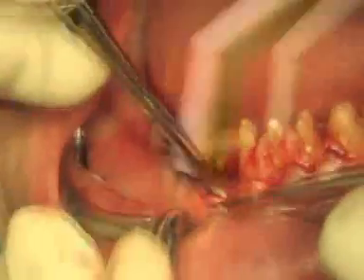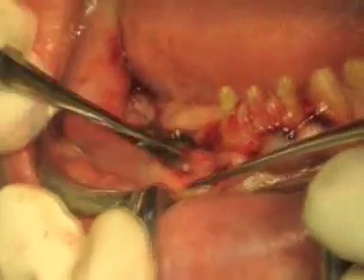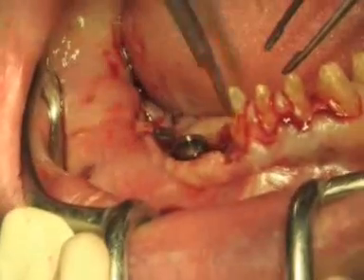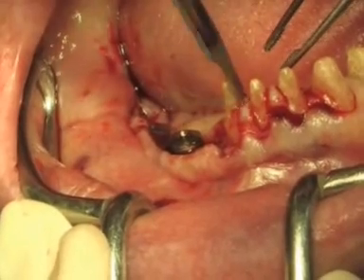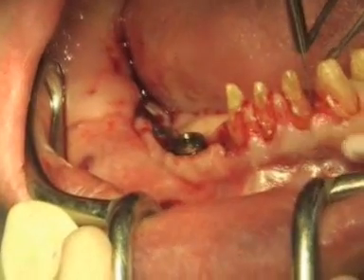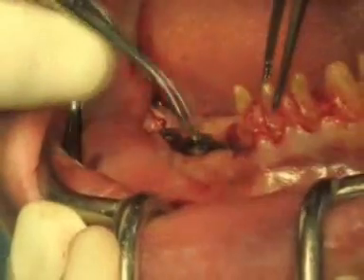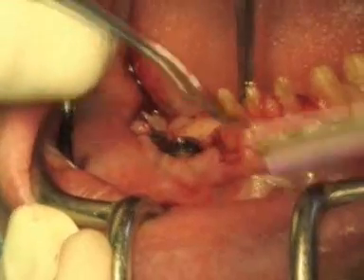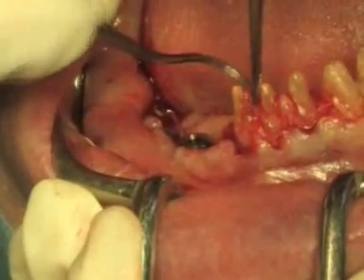Clinical crown lengthening is carried out on the natural teeth. First, using hand chisels, an ostectomy is carried out, and scalloping at the vestibular level. At the lingual level, the removal of supporting bone. The roots are planed to increase the interproximal spaces and carry out the clinical crown lengthening. The healing pillars will be positioned above the implants, and at this point the bone margin is still high at the level of the teeth, but the difference, thanks to this surgery, has been decidedly reduced.